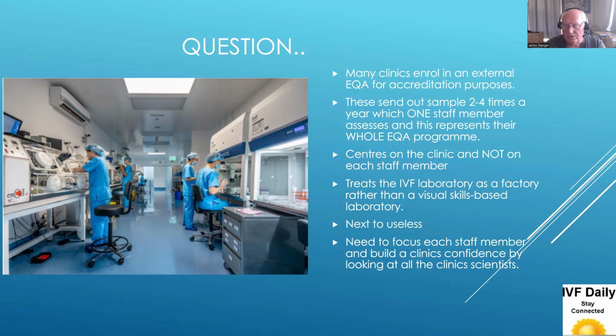Whereas I believe what we should be doing is testing staff members' visual skills on a laboratory basis. So I'm being quite naughty saying they're next to useless. That's why I wrote this program. I used them for quite a few years when I ran IVF programs early, and I actually got rid of it because I just hated the concept, the one sample which you had to submit and then wait 2 months for it to be processed and released in a static sort of way. It just didn't, for me, meet my needs.